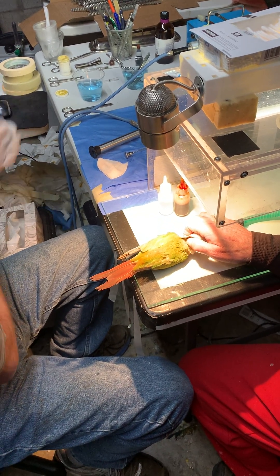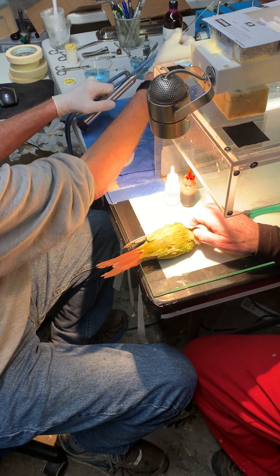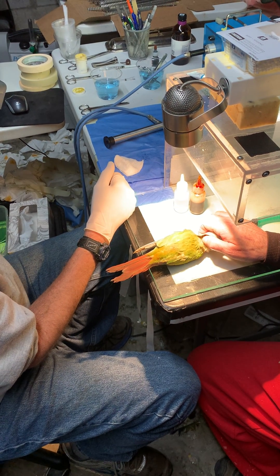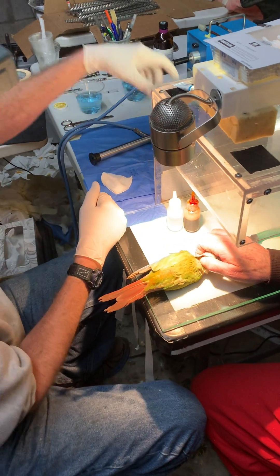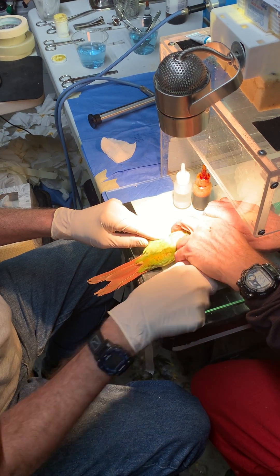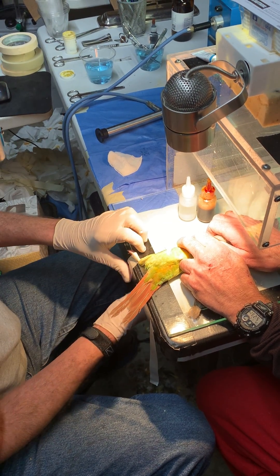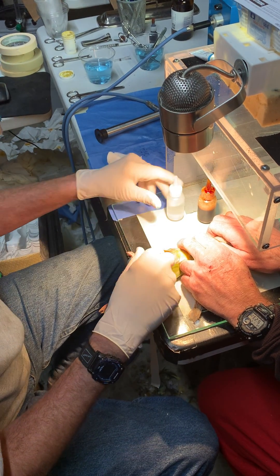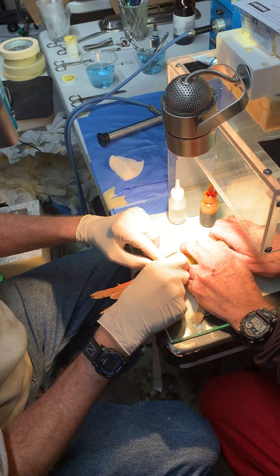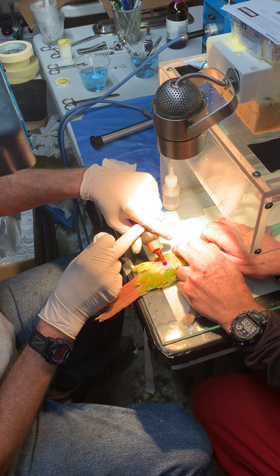The bird is being anesthetized. The left side is the entry point. So parrots have an active ovary on the left side. Since he doesn't know what he's sexing, he's going in on the left side so that it can be visualized if it is a female.